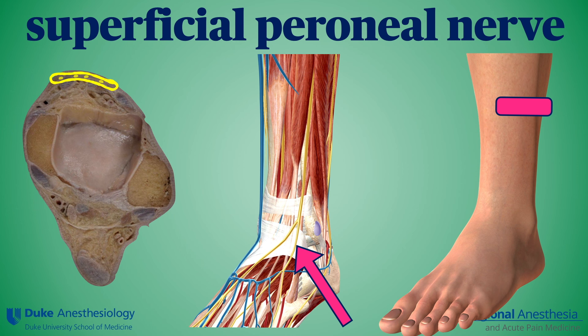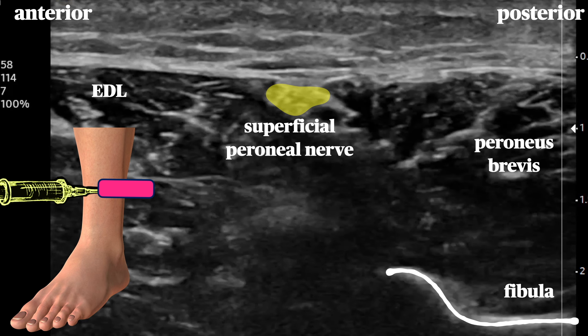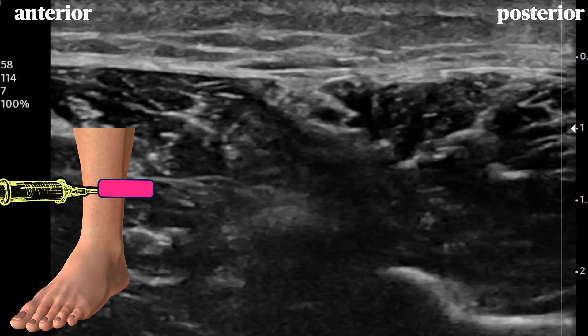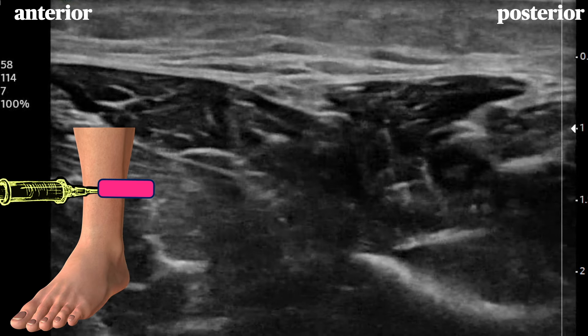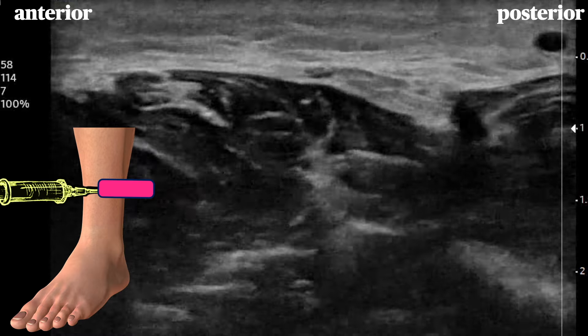The superficial peroneal nerve, which innervates the dorsum of the foot, is often anesthetized with a field block across the top of the foot after it's branched multiple times. With ultrasound, this nerve is easily seen about 10 centimeters above the ankle on the lateral calf, hanging off the deep fascia of the leg between peroneus brevis and extensor digitorum longus muscles. The fibula often seems to point at the nerve. As the probe is slid distally, the nerve can be seen piercing the fascia and branching. Our preference is to block it in the proximal location prior to the branching.